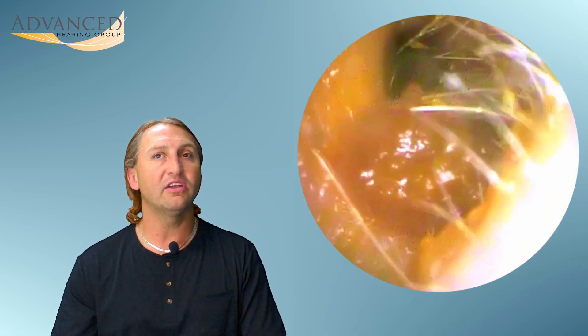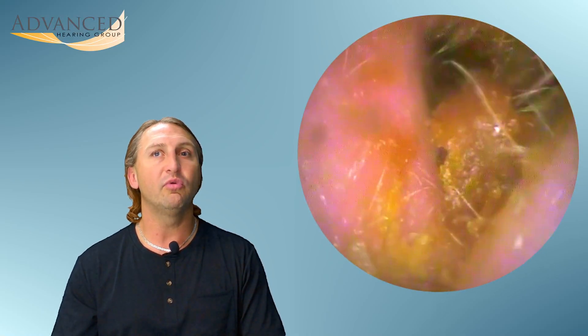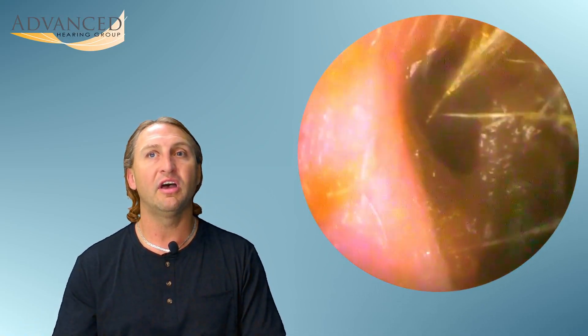Let's go on here to get another wax removal. This time the coloration of the earwax is completely different. We're going to use this curette here to remove this. I tend to be a little bit more aggressive than my student as she hasn't been doing this quite as long.